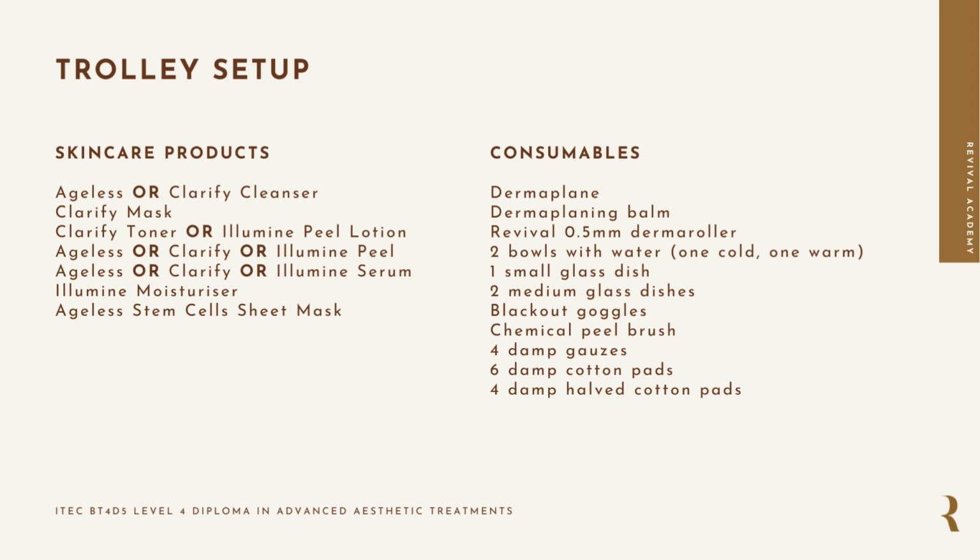Keep in mind that all clients have different skin concerns and skin types, so it will be up to you to select the most suitable skincare products depending on the client's skin and their needs. And then on the right, you will find the list with all the consumables that you would need to have ready and prepared on your trolley. Make sure that your trolley and working area is completely set and ready before the client actually arrives. Once you have everything in place, you can begin the dermaplaning treatment. Now let's look into what the treatment steps actually involve.